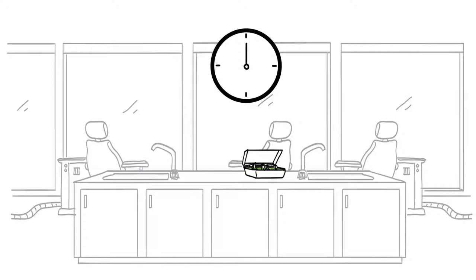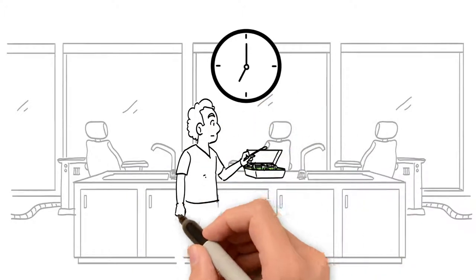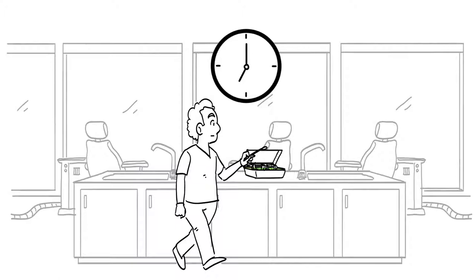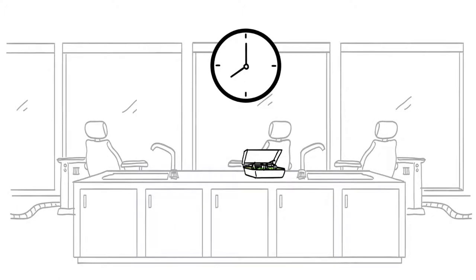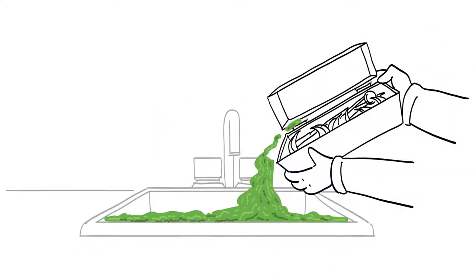Here's how it should be done instead. First, the dental instruments should be washed with hot soap and water and put inside a dental bag. Then the bag is placed on an autoclave sterilizer, which is turned on. Afterwards, the instruments are completely clean and ready for use again.